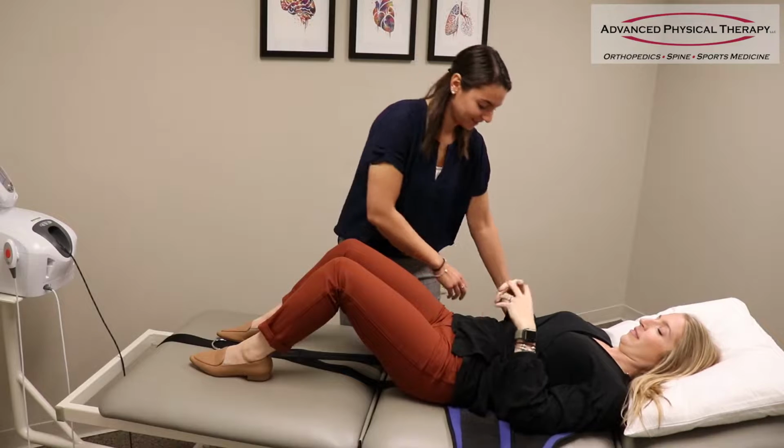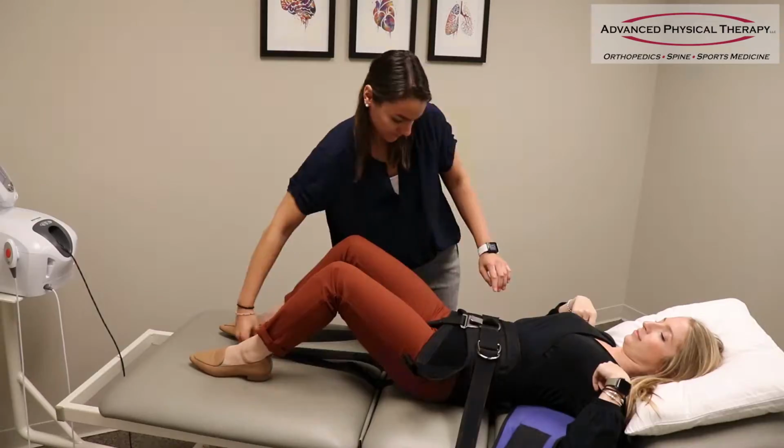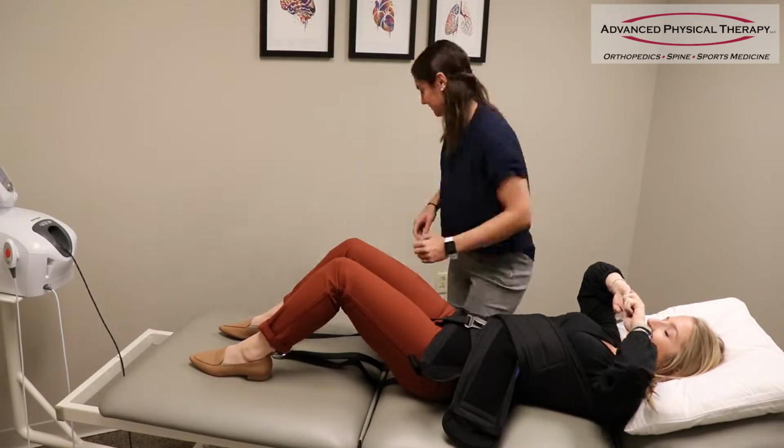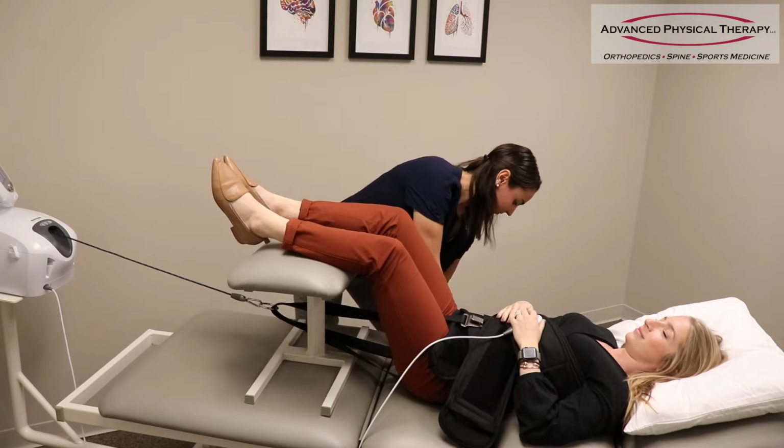Traction is a commonly used intervention in PT practice to decompress the spine by providing a loaded or weighted stretch to either the lower back or the neck. So you can either treat the neck or the lower back. When we treat the neck, we're using cervical traction, and when we're treating the lower back, we're using lumbar traction.